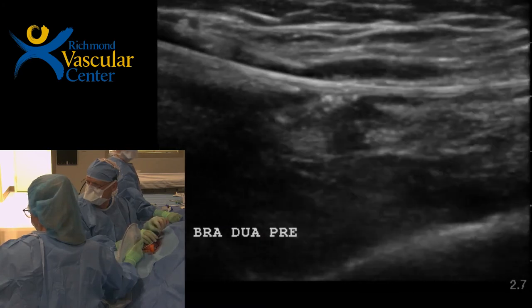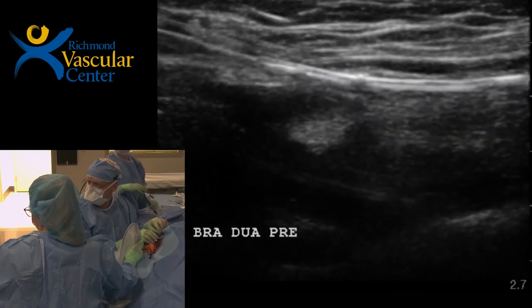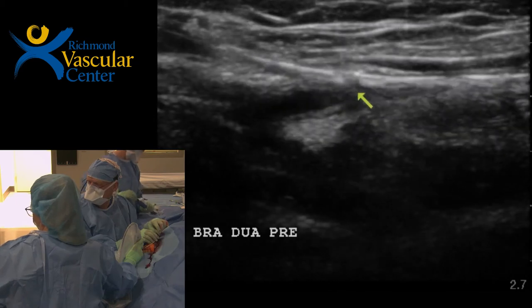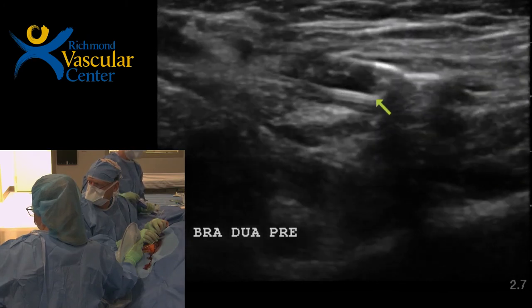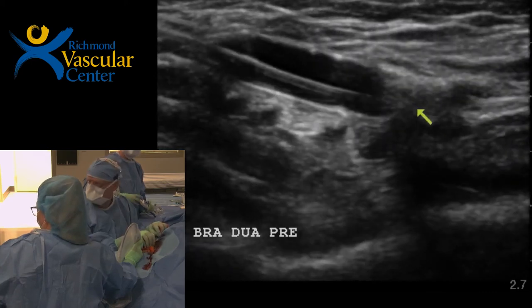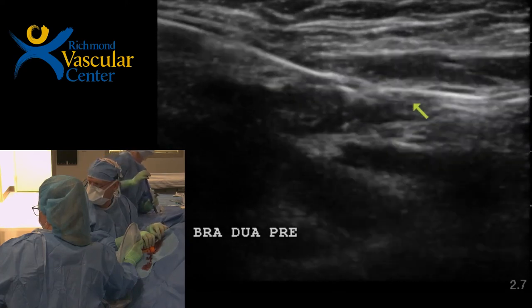Okay, you can see the sheath there. I'm going to pull it back a little bit. And there we are, we're crossing easily. All right, and balloon up. So it's watermelon seeding out. No, leave it up. Let's see. We'll go down again, we'll go down a second. So with a smaller artery, you're going to tend to get this watermelon seeding. Go back up again.